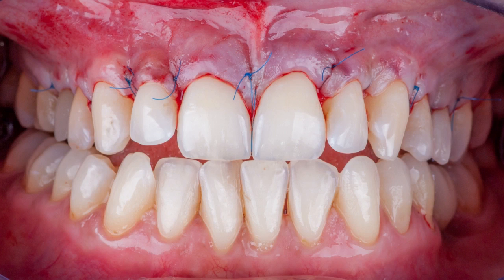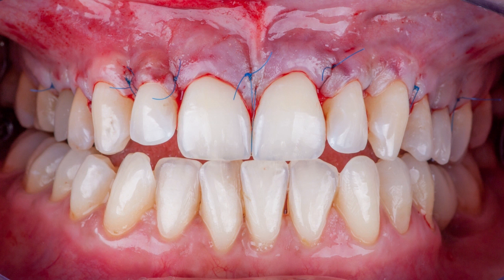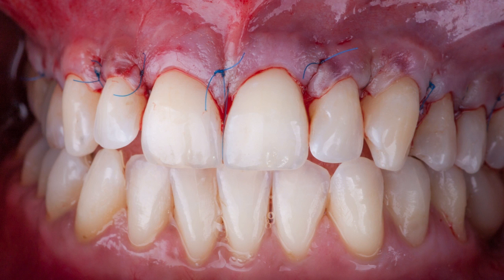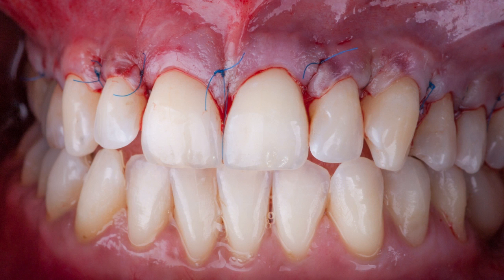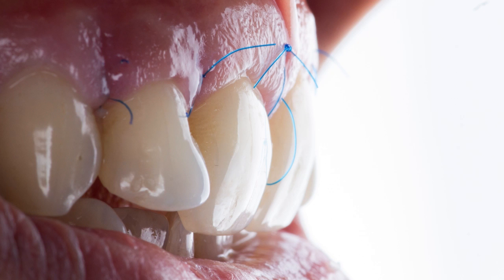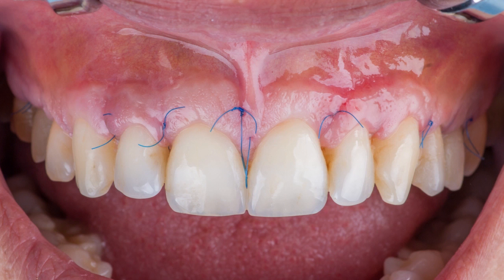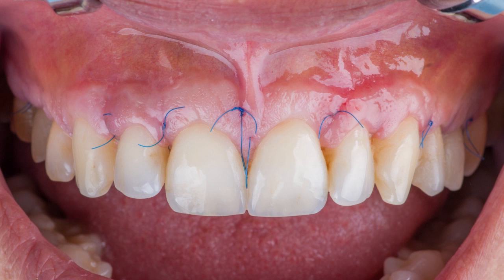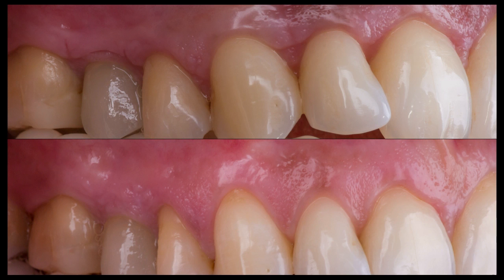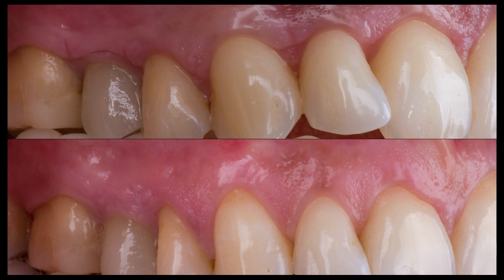Here you can see the results immediately post-op. And here it is side by side with the initial presentation, after one and a half months.